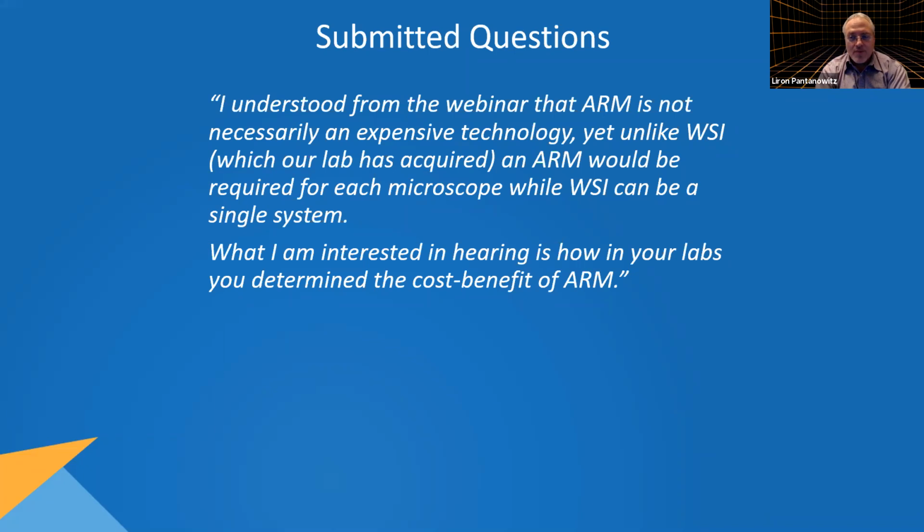Yeah, Gabe, so my perspective on this question is as follows. Many people underestimate how expensive it is to implement whole slide imaging because they think WSI is the scanner. In fact, the scanner is the cheapest part of the whole thing. When you talk about, as the question actually says, the WSI system, there's the scanner, then you need the image and case management software and a license and perpetual maintenance on that. Then you need a server to at least host the images, and if you want to keep them for longer, that's even more expensive. You need a digital cockpit for the person to work at where the viewer will work, okay? And if you want an FDA cleared system here in the US, then those are quite pricey.